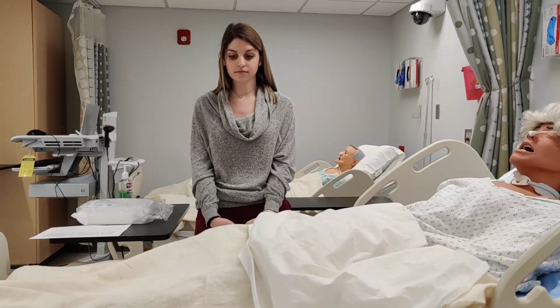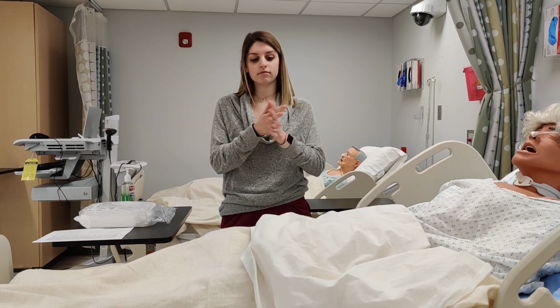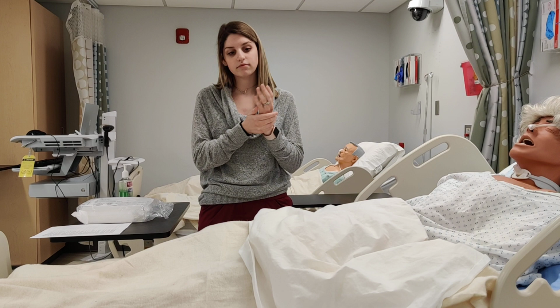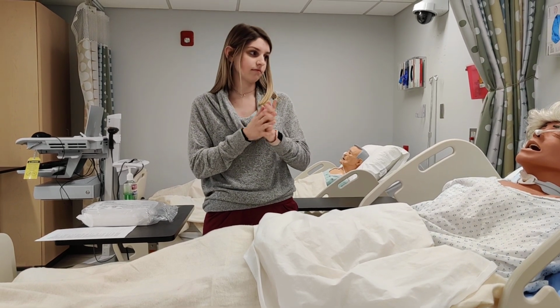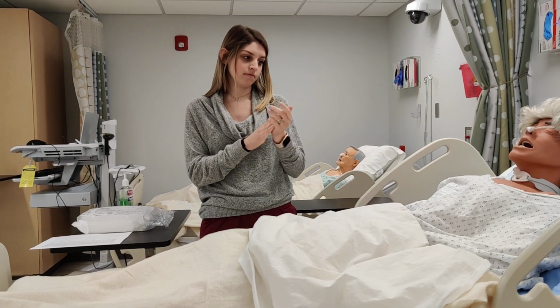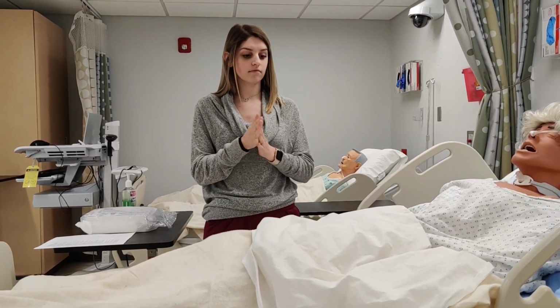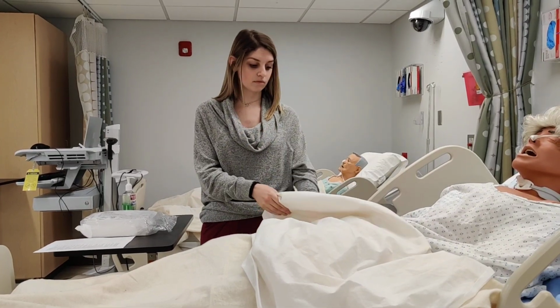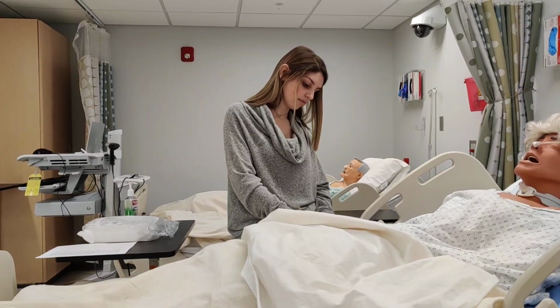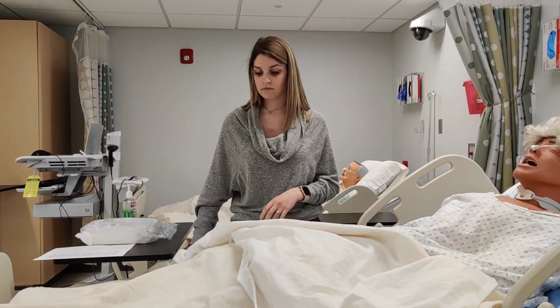Upon entering the room, Gabby's washing her hands. And we want to be sure to go through our steps of identifying our client, checking that wristband to make sure that the name they're saying does match. We're asking, once again, that name and date of birth. We want to ask about allergies. Some of the Foleys come in latex, and if our client has a latex allergy, we want to be sure to have a Foley that is silicone-based.